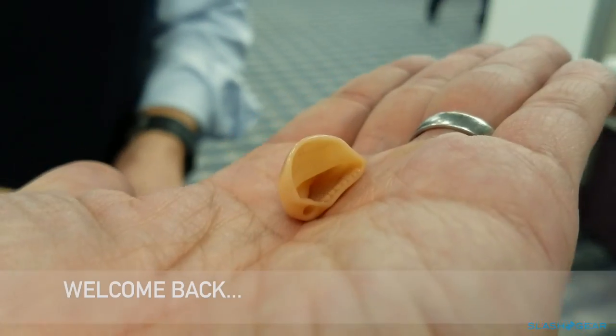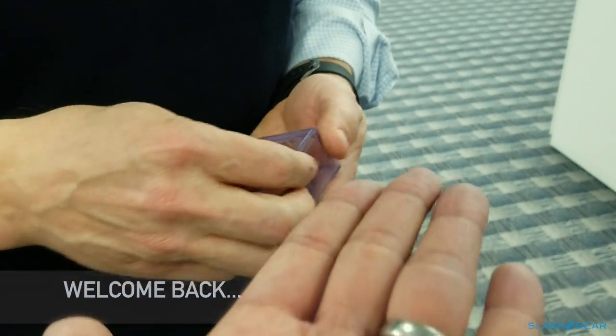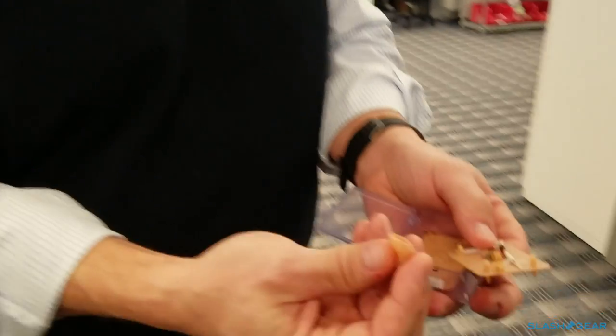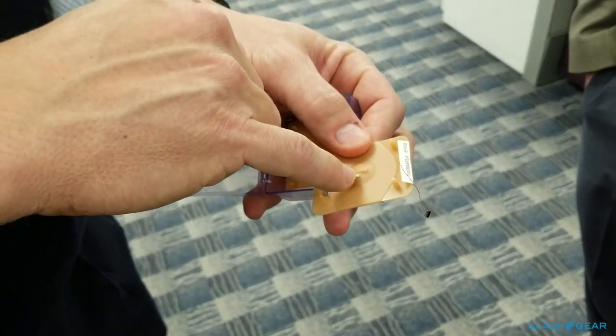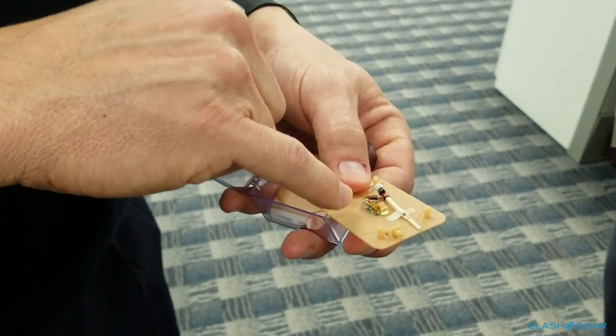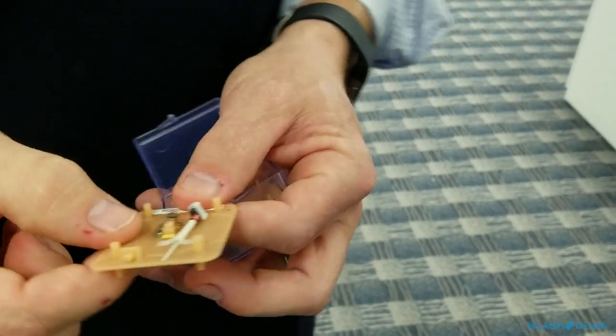The neat thing about custom hearing aids that I like to tell people is you have this unique marriage of super high tech — and at the end of the day I'm using glues, cutting with a razor blade, and grinding the shells to finish them properly. All the components go onto what we call the faceplate: the microphones, the push button, the battery door on the back side, the chip, the back side of the microphones, and the receiver — the actual part that amplifies the sound. Our technicians assemble all of this.